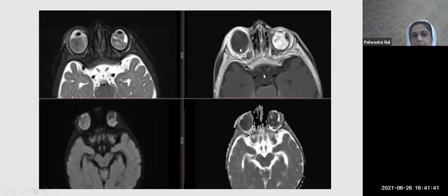So in your exam, in retinoblastoma, you have to use typical buzzwords: transscleral spread, perineural spread, trilateral, quadrilateral retinoblastoma, and look for leptomeningeal metastasis. DWI is a great sequence when it comes to retinoblastoma.